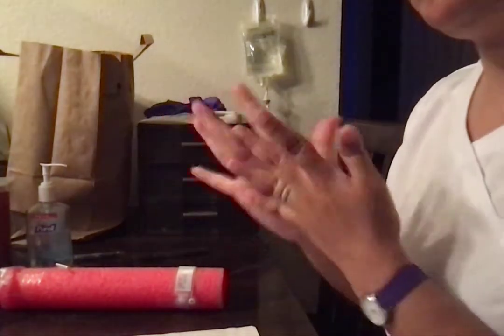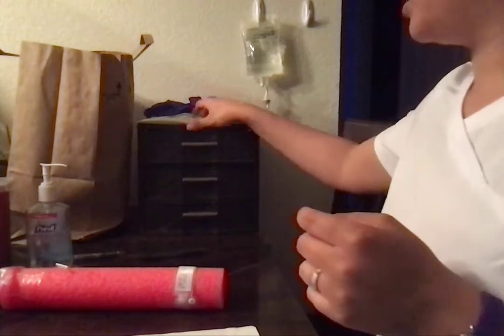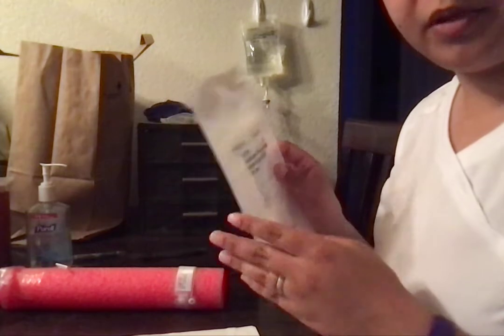Hopefully you can see everything all right. Okay, so we have our mini bag of ciprofloxacin. So now that I've pulled the med, I'm going to do my double check against my MAR.